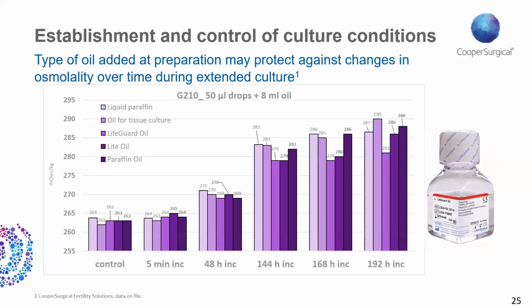Even if you don't use them for other times of the year or for other processes, for long-term cultures, it may be appropriate to think about a heavier oil under certain circumstances. So again, there's no one rule fits all, not one answer to every lab. You have to look at your own system and determine how stable it is and what you might be able to do to help it. But thinking about the type of oil that you use can be one area where you might see some improvement.